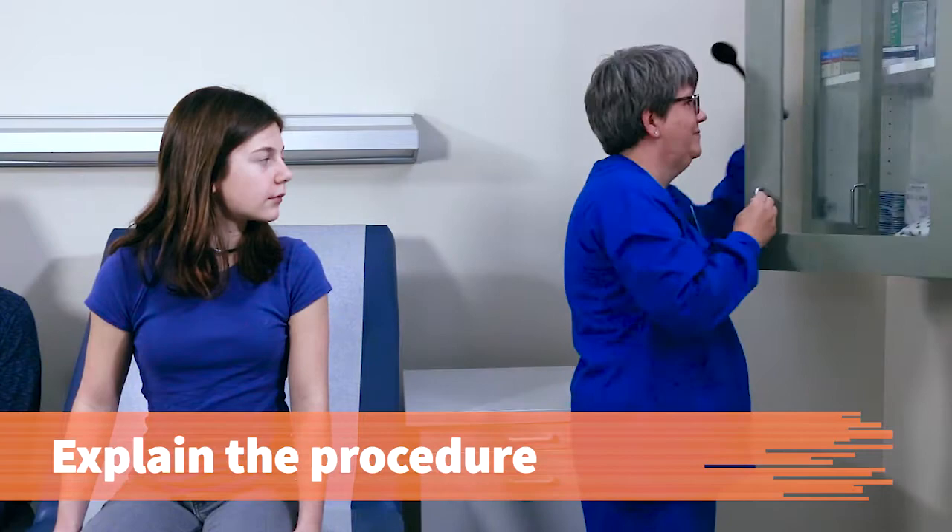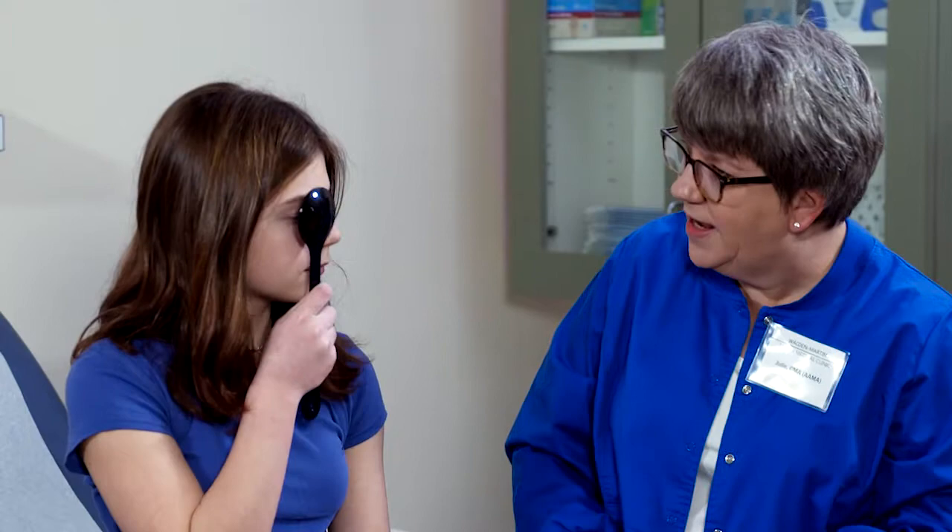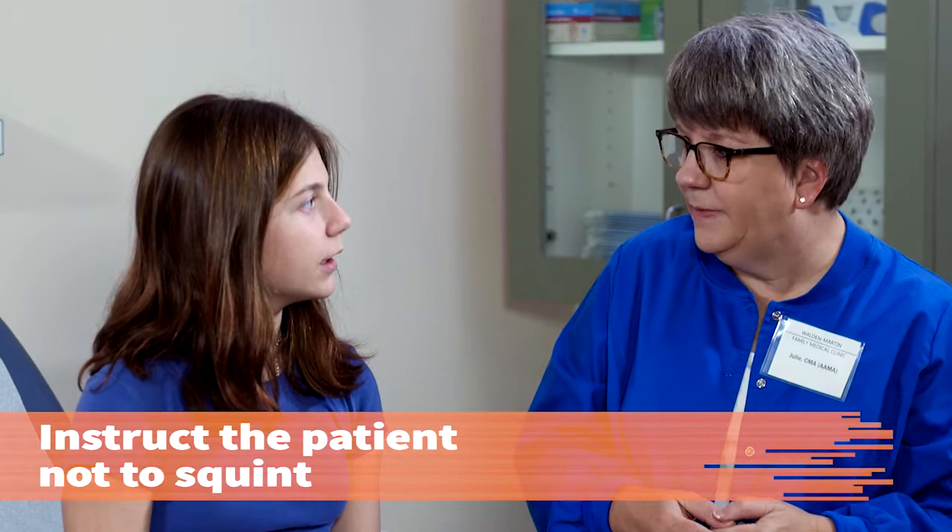Explain the procedure. We're going to be doing a vision test today and I'm going to have you use this occluder to cover one eye at a time. You can go ahead and hold that and give it a try. That's what we need you to do. And while you're covering that eye, I'm going to have you look at a chart and read the different letters on it. They're on a number of different lines and we'll have you work your way down. When you're done with one eye, we'll move to the other.